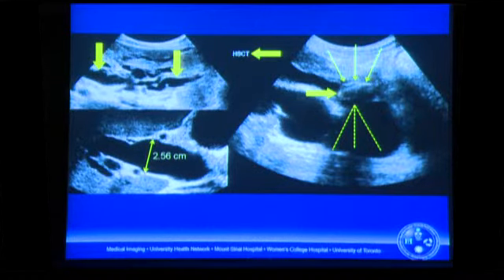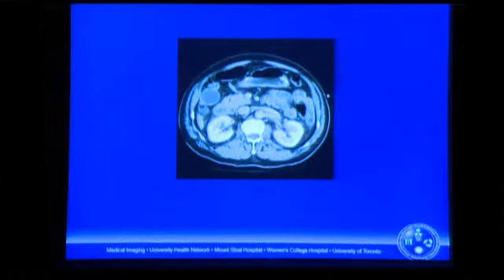So you have to be aware of that with gallstones, with kidney stones, and on some of the modern machines now, it's almost impossible to completely get rid of compound imaging or sono-CT. Now, you won't always see a stone with ultrasound even though you suspect it's there. And in our practice, at least on weekends and after hours, we rarely have ready access to MRI. So you can use CT scan to complement the ultrasound to demonstrate a CBD stone.